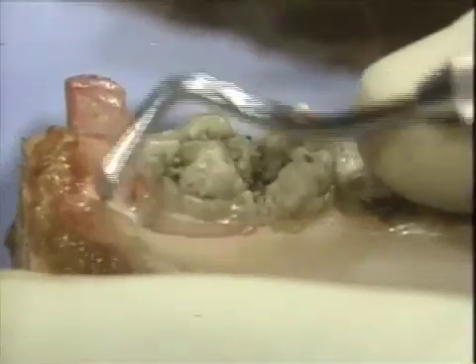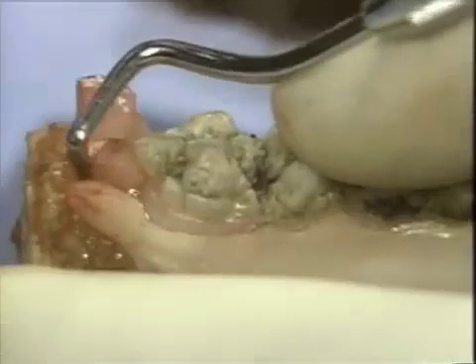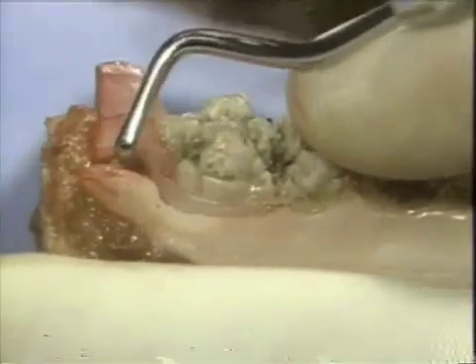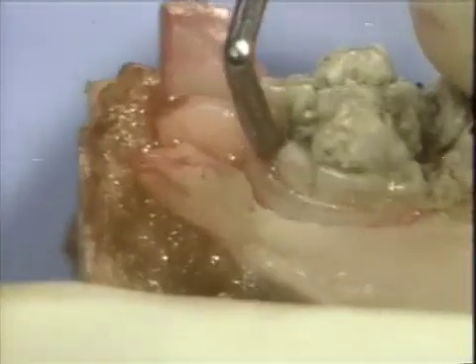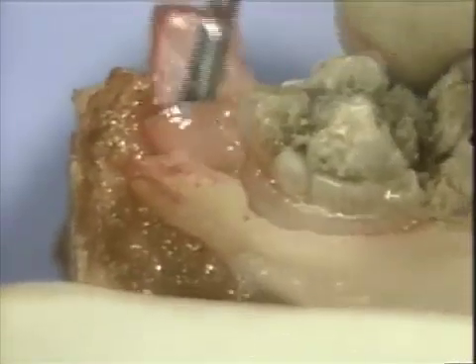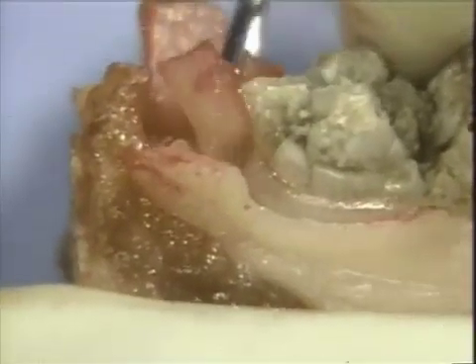An interproximal knife such as the Orban knife can be used to sever fibrous attachment between the wedge tissue and the underlying bone. Once this tissue is released, it can be grasped with a mosquito hemostat, placed under tension, and sharply excised from its osseous bed.